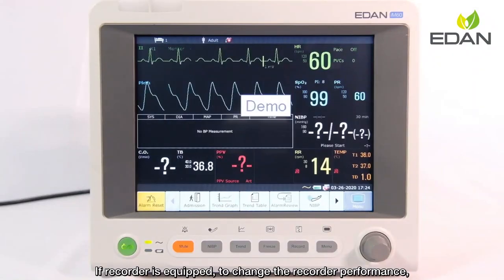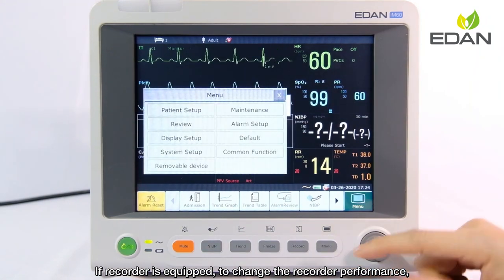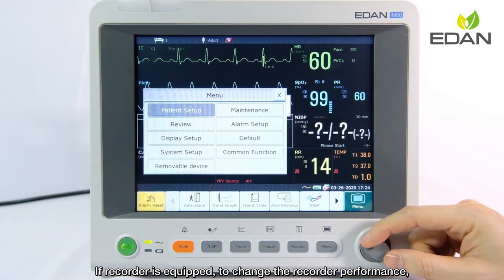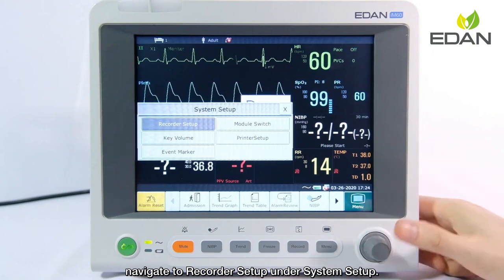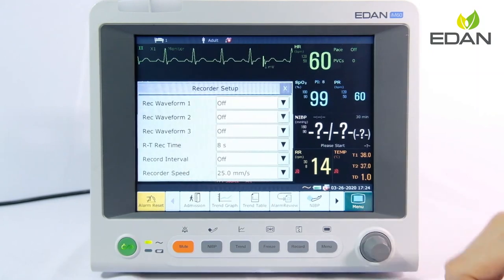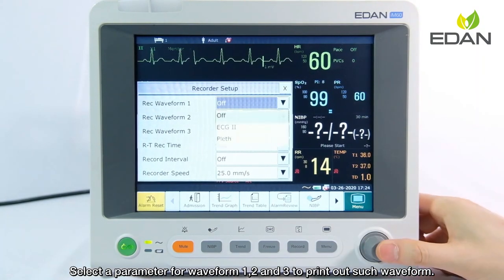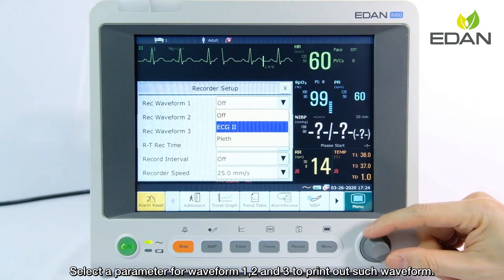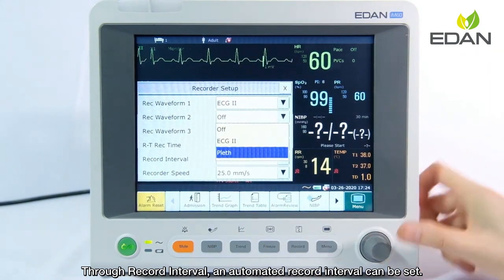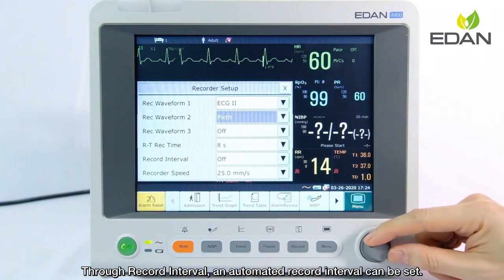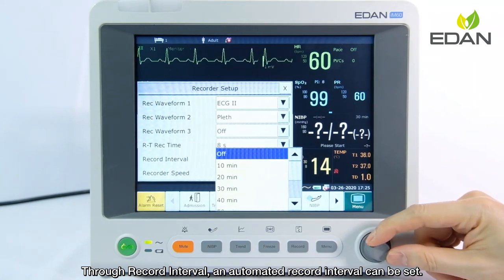If a recorder is equipped, navigate to recorder setup under system setup to change recorder performance. Select a parameter for waveform 1, 2, and 3 to print out those waveforms. Through recorder interval, an automated recorder interval can also be set.